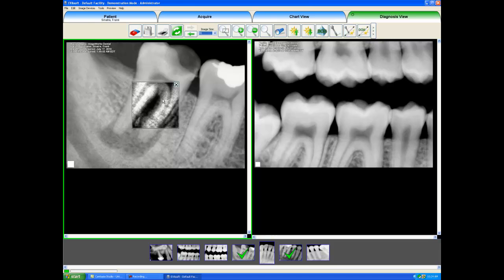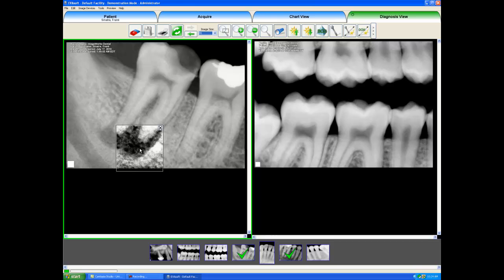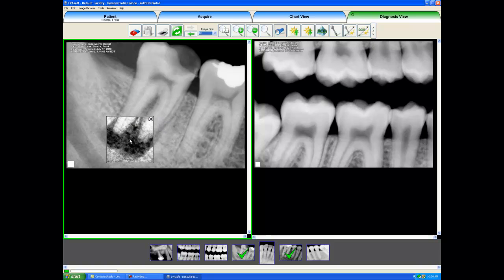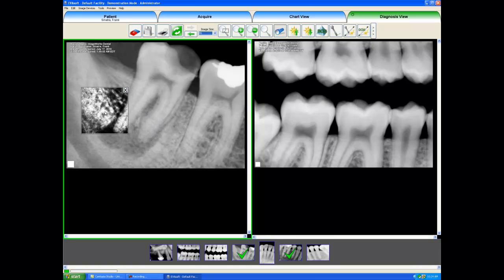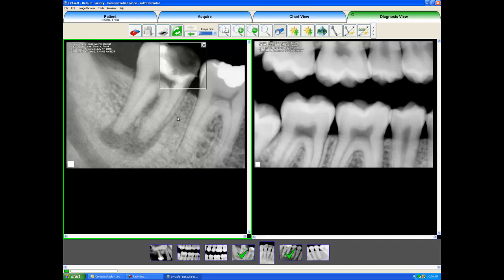So as we see here on this tooth, I will click and drag the caries spotlight over the image, and we can see the pathology under the apex. It clearly gets very dark, and we can see the surrounding bone around it is white. Or we could look at the decay up in the tooth and the crown, and we can see the sharp contrast. Now with this tooth it's very obvious to see all of the pathology that surrounds it. So let's find another x-ray.